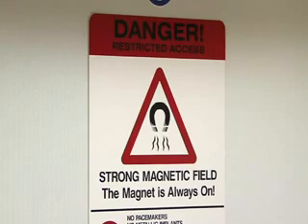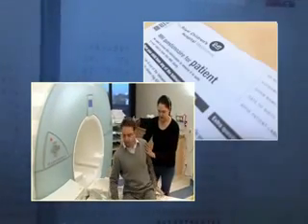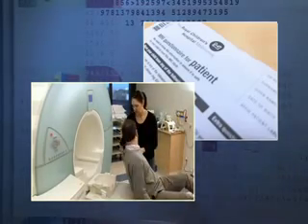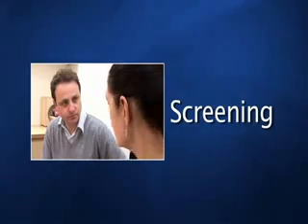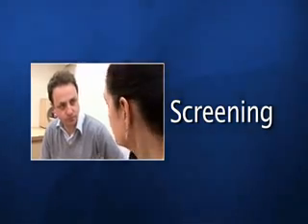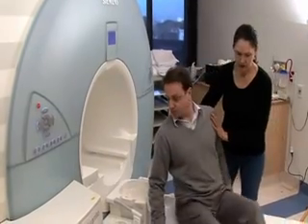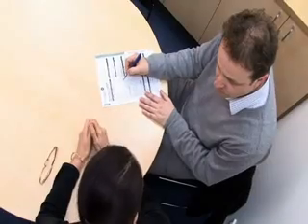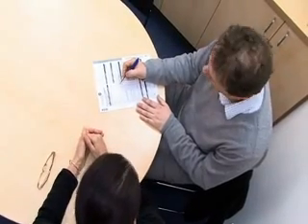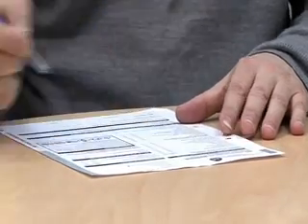This short video explains the MRI process and outlines some of the preparation and safety precautions required to perform fMRI research. Okay, Phil, you just slide down here. A trained resident technician will be present and in charge at all phases of your research. This includes pre-test screening and preparation. All subjects are screened and need to fill out a detailed questionnaire before entering the MRI area.